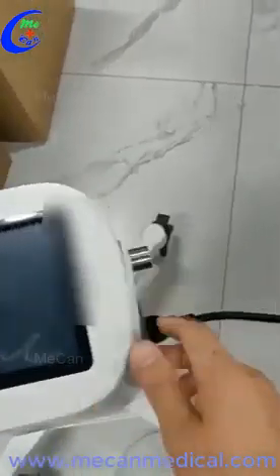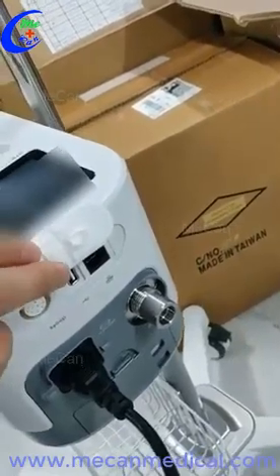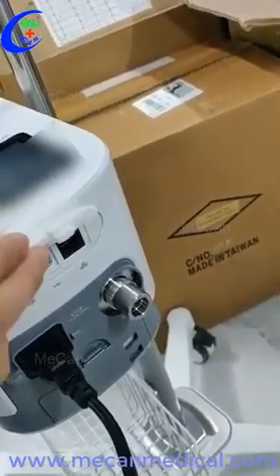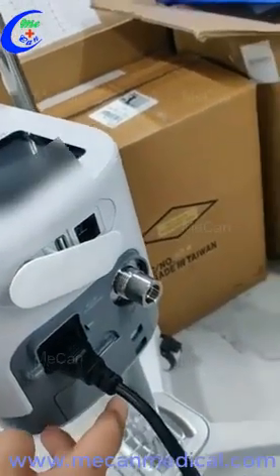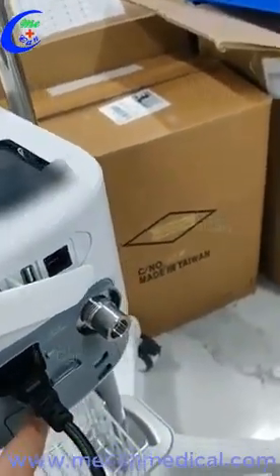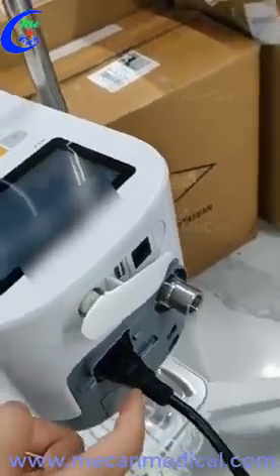The back of this has the SPO2, USB, and also the network port. And this connects to the oxygen sources. Because this has the built-in turbine, there is no need for an air source. AC power port.